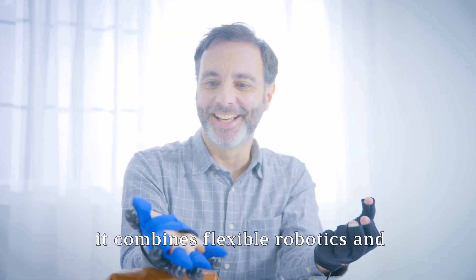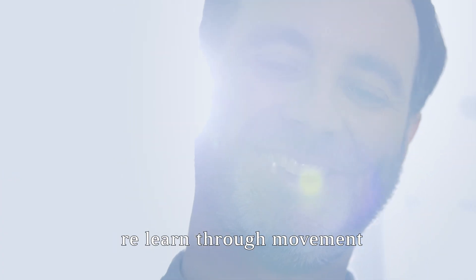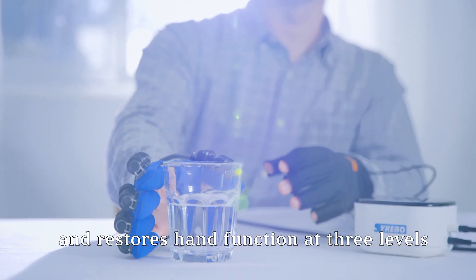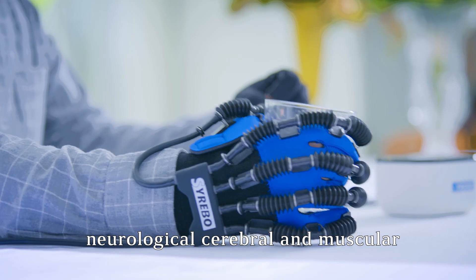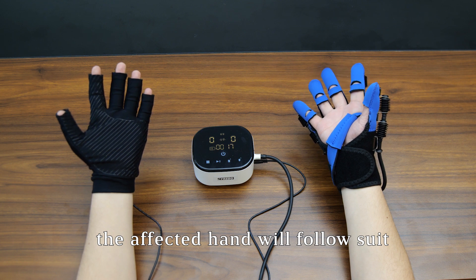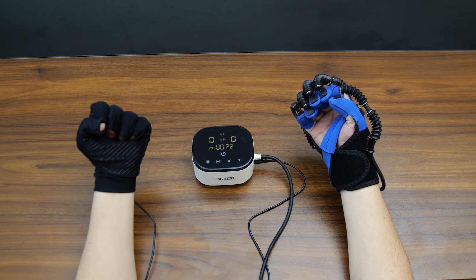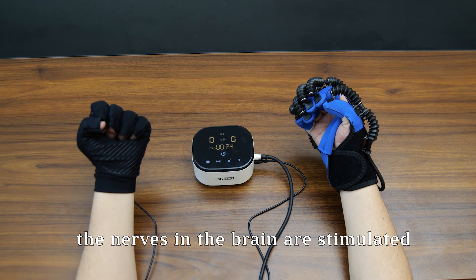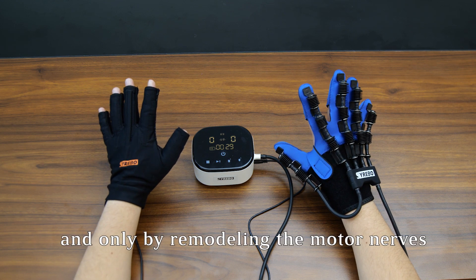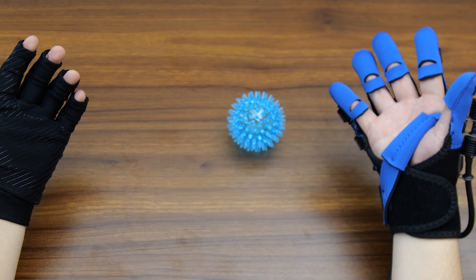The mirror image training combines flexible robotics and neuroscience to help people with hand impairments relearn through movement. It improves hand mobility and restores hand function at three levels: neurological, cerebral, and muscular. As my hand opens, the affected hand follows suit, and as the grip tightens, the affected hand follows suit. During this movement, the nerves in the brain are stimulated to remodel, and only by remodeling the motor nerves can the affected hand recover better.